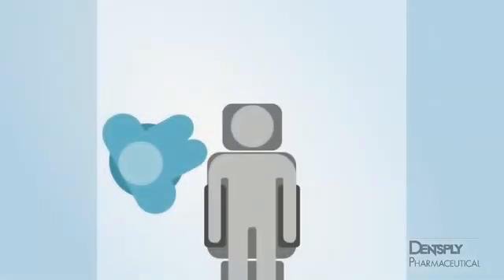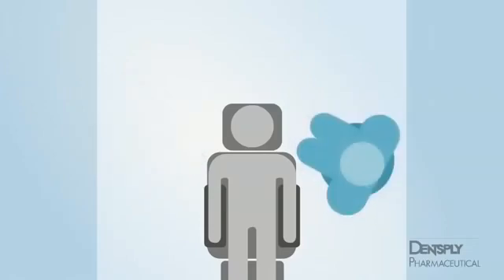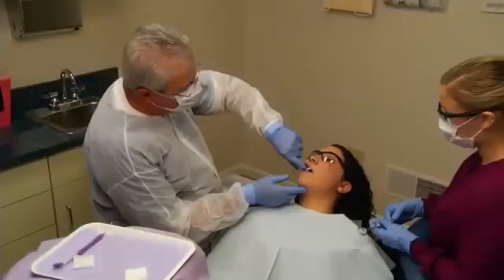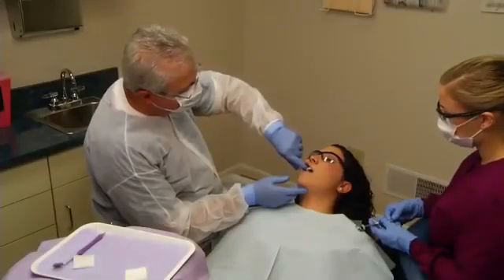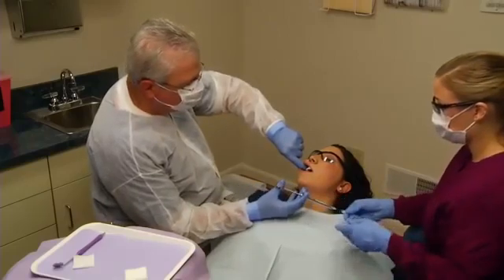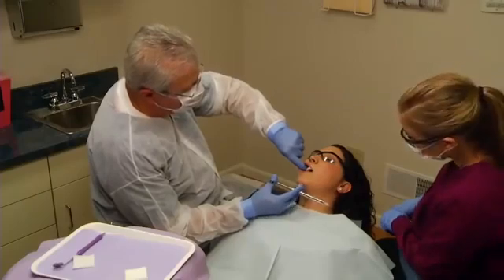For a right-handed operator performing a middle superior alveolar injection, the clinician may be seated in the 8 o'clock position for the right side or 9 o'clock position for the left side. For a left-handed operator, the clinician may be seated in the 4 o'clock position for the right side or 3 o'clock position for the left side. The alveolar mucosal tissue is palpated at the injection site in the vestibule at the height of the mucobuccal fold superior to the apex of the maxillary second premolar to ensure only soft tissue is injected.